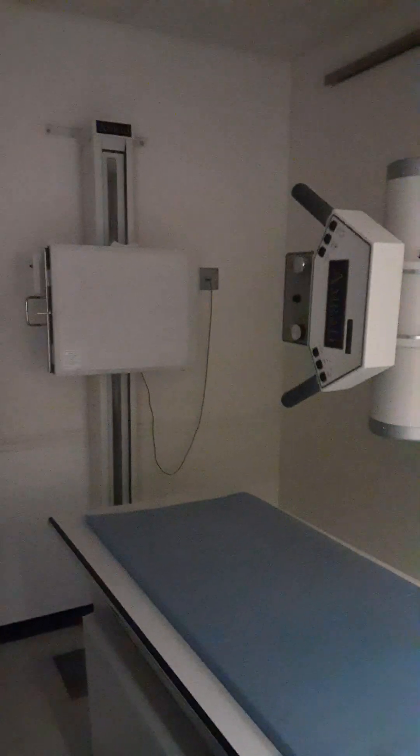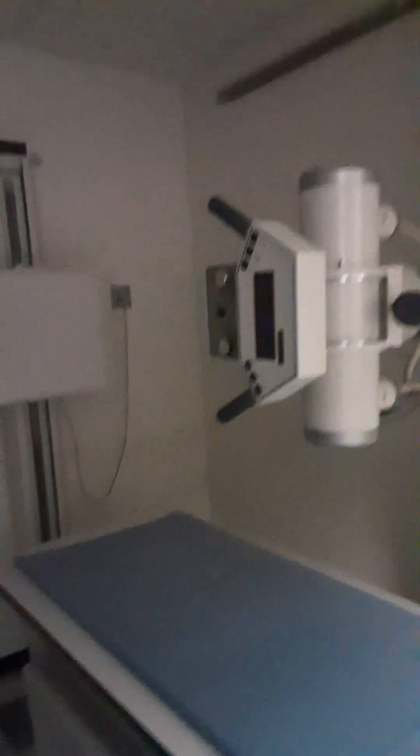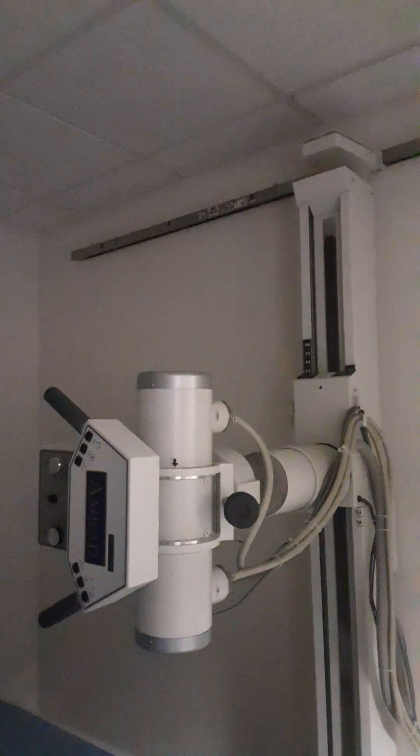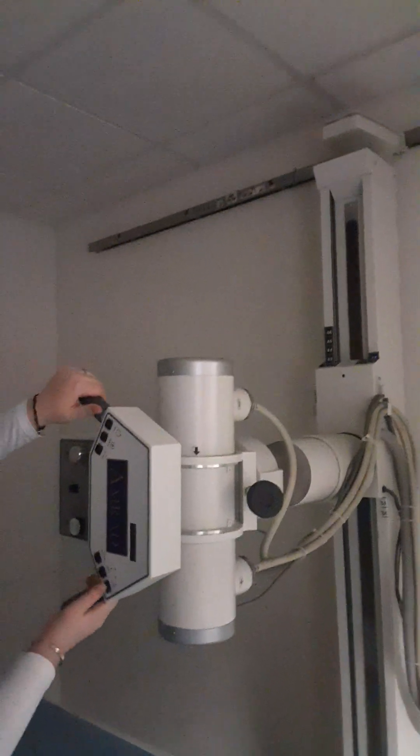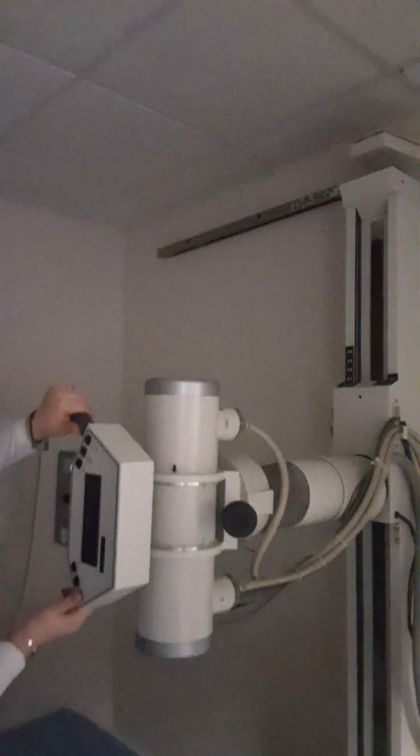Right now we're starting with our wall bucky orientation. We're going to move our SID to 40 inches. We're going by the arrow at the top to the number on the movement.